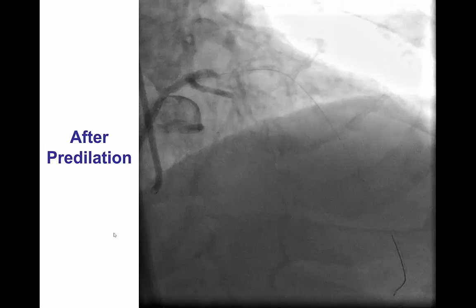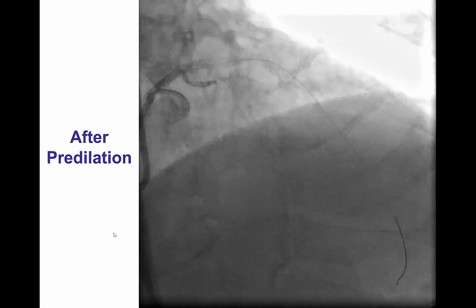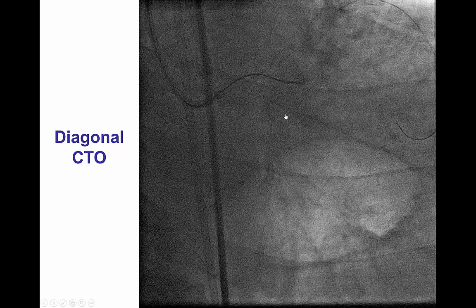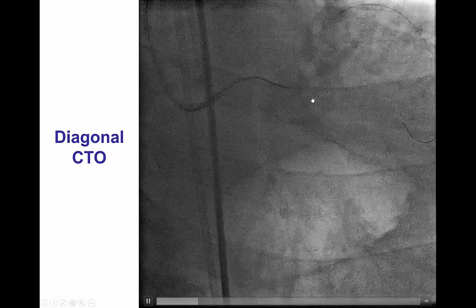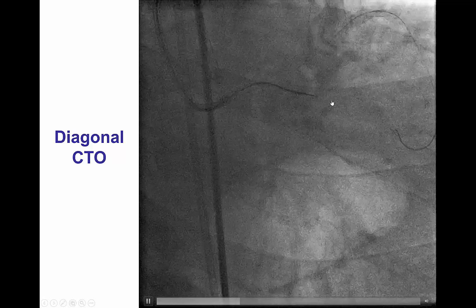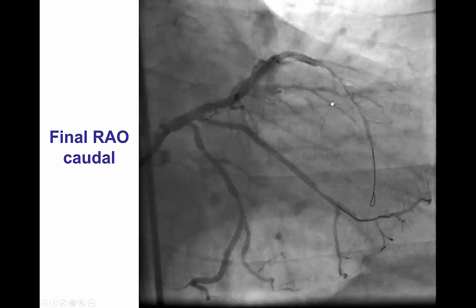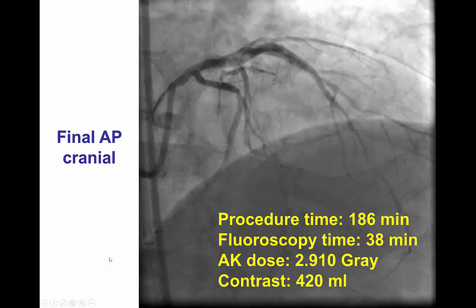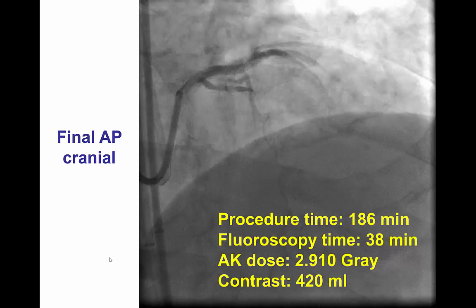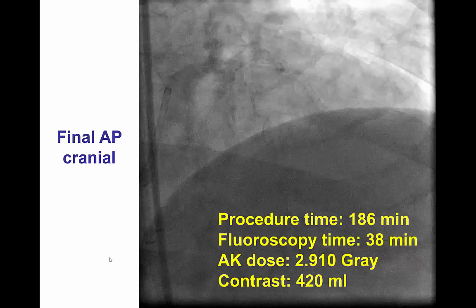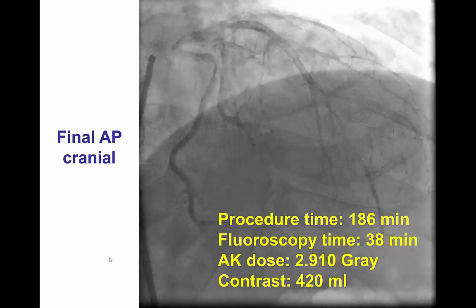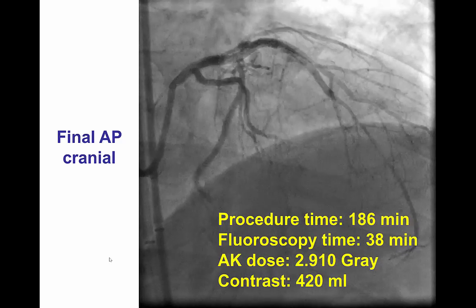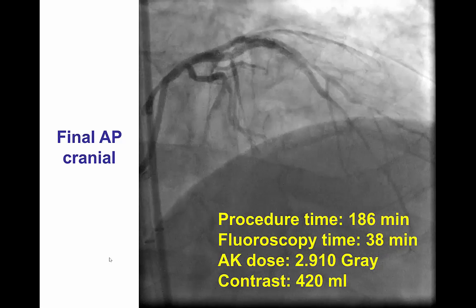The lesion was predilated and antegrade flow was restored, with maintained flow into the large diagonal branch near the distal cap. We also treated a first diagonal CTO that was easily crossed with antegrade wire escalation. After stents were placed, antegrade TIMI flow was restored in both the LAD and the diagonal branch, with a nice final angiographic result. The case took approximately three hours, 38 minutes of fluoroscopy at 2.9 Gray with 420 mLs of contrast — demonstrating that balloon uncrossable lesions can be challenging and require multiple strategies.